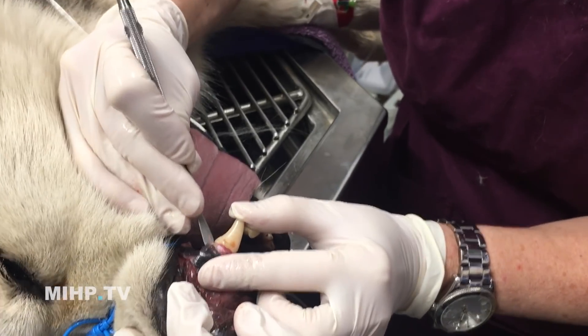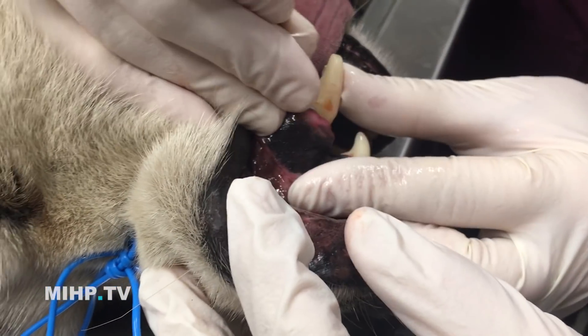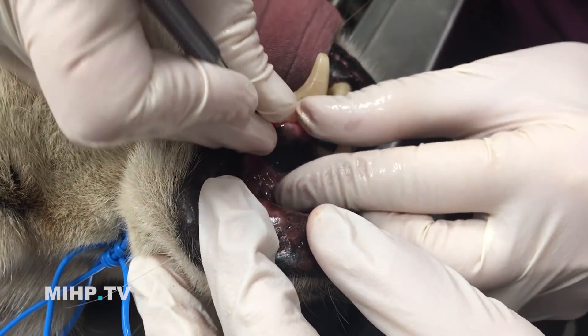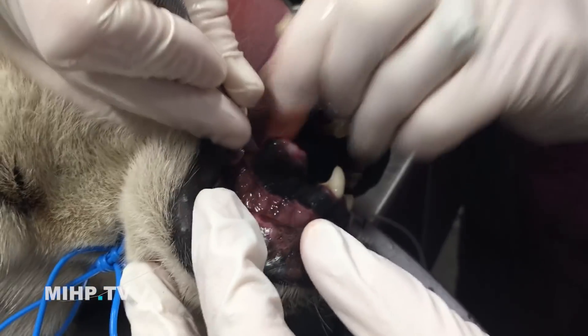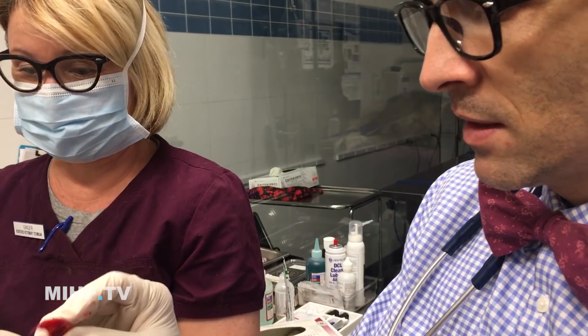Don't push this. So now we're just elevating the gingiva off of the tooth, and it should pop right out. There it is. Oh my god. Easiest extraction ever.